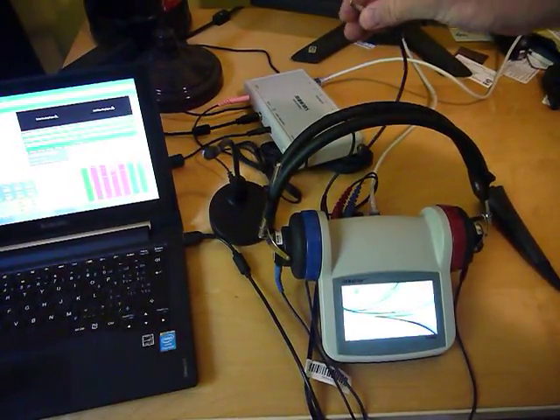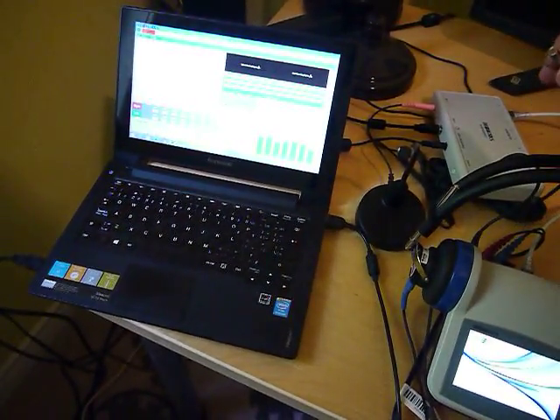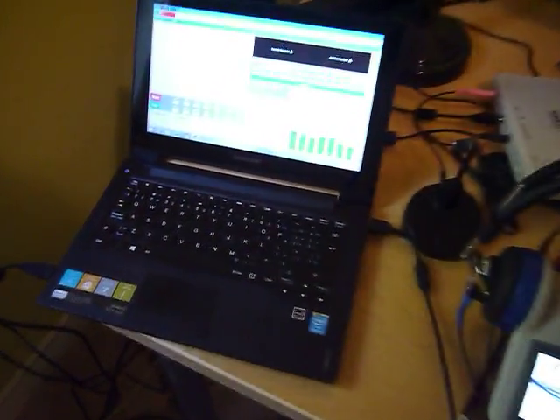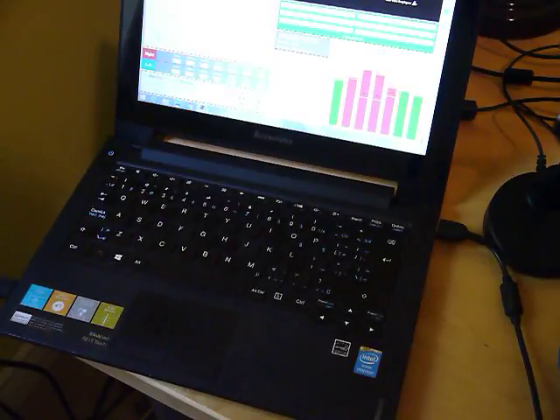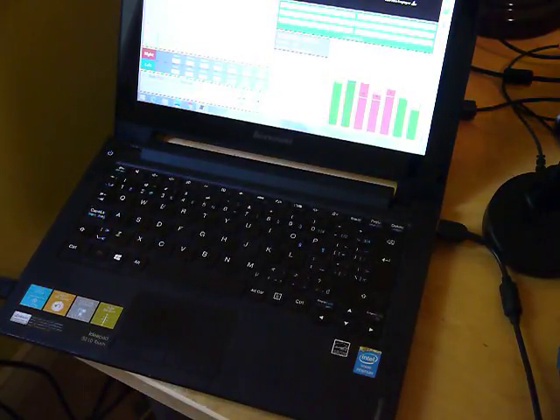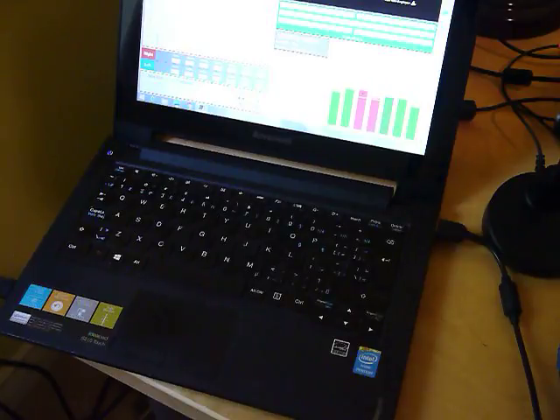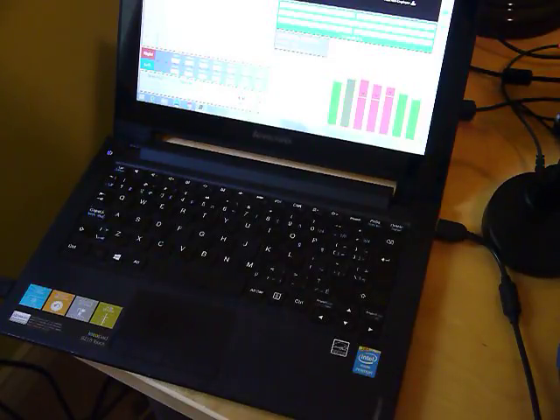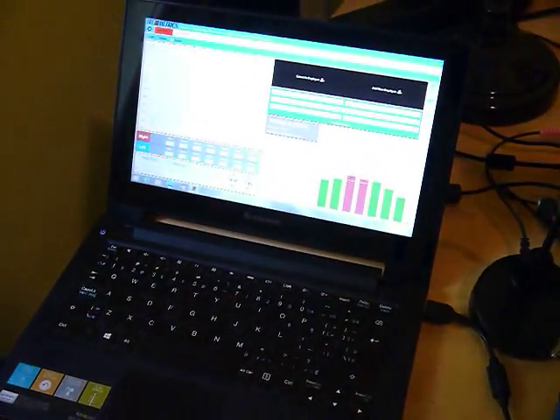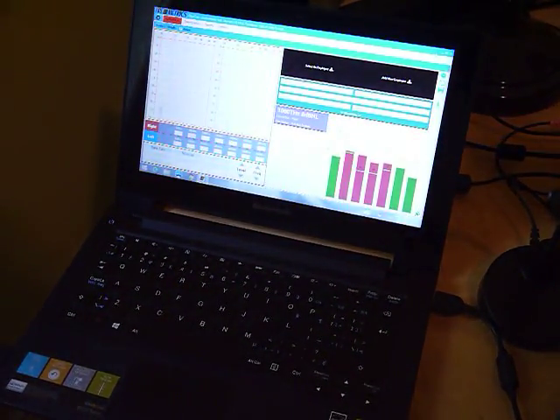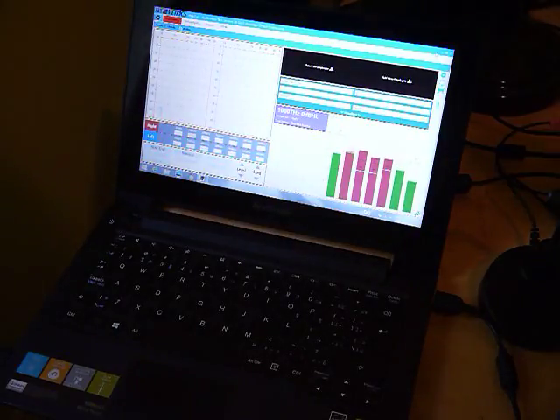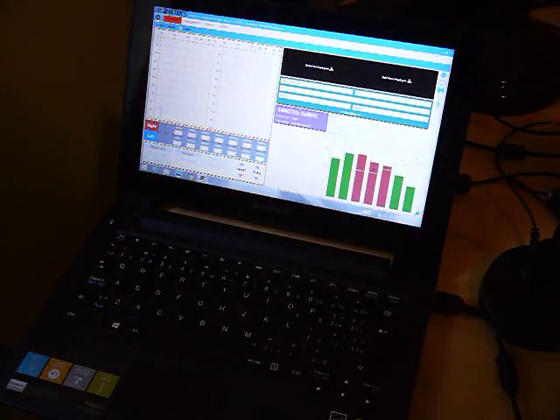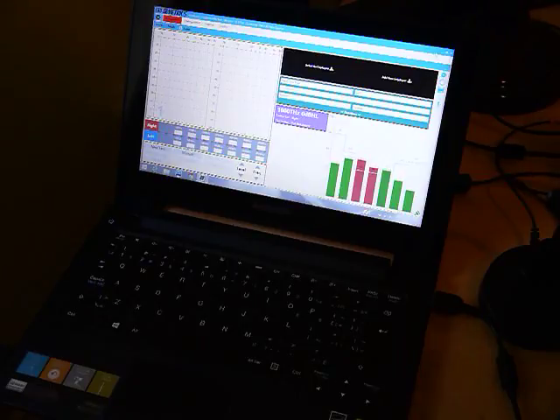You can see as I'm speaking, the software is giving a real-time reading of the room noise. The idea of this audiometer is that if the background noise gets too high it will pause the test, so you know you have a good test. You don't have to worry about the background noise and you can monitor it.